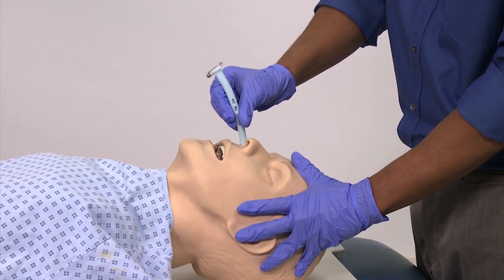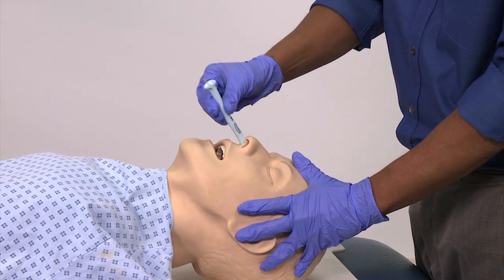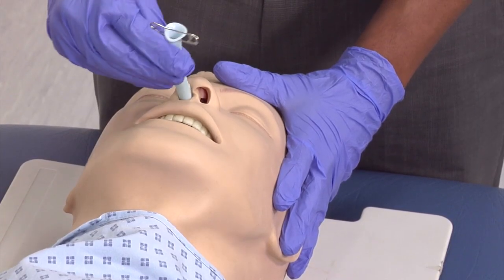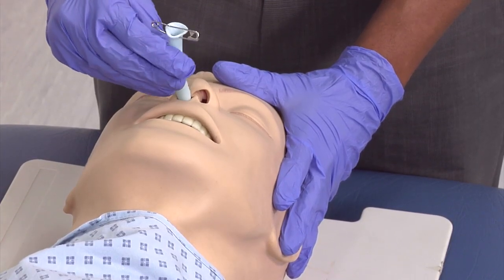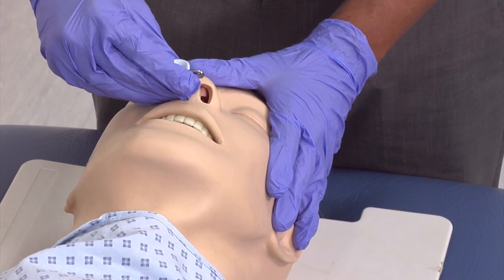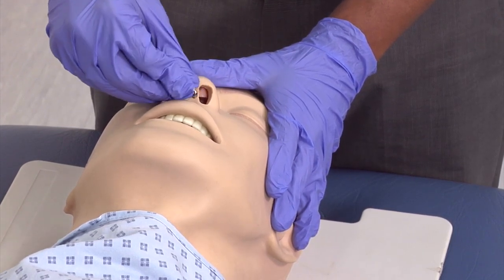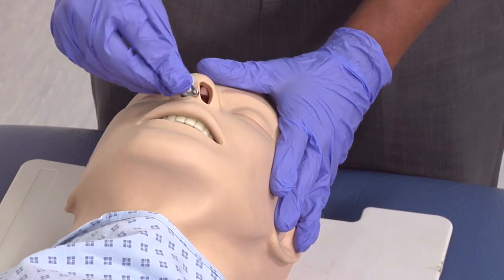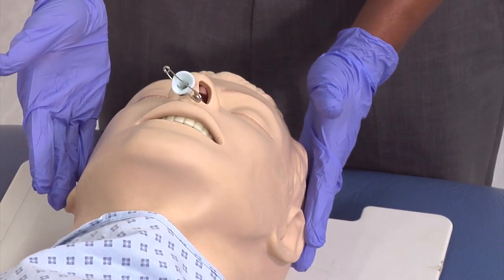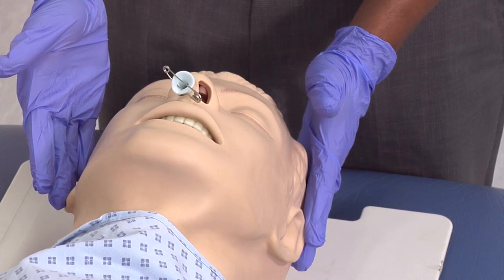Push posteriorly so that the airway moves backwards along the horizontal floor of the hard palate and not upwards into the cribriform plate. A slight twisting motion may help push the airway in. Keep going until the flange end is at the nostril, which means the airway is into the posterior pharynx.